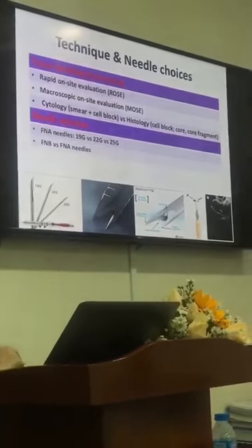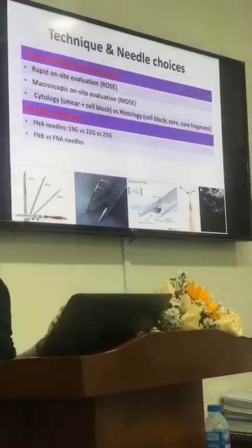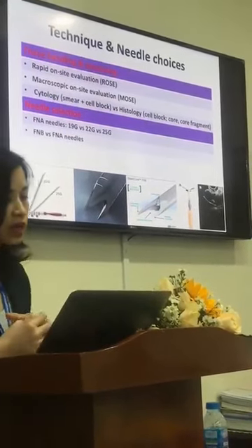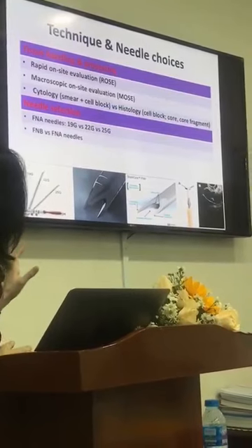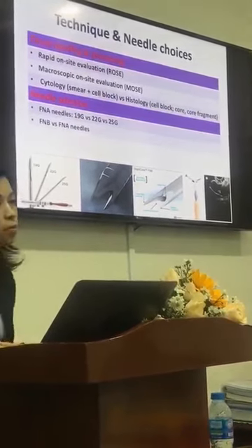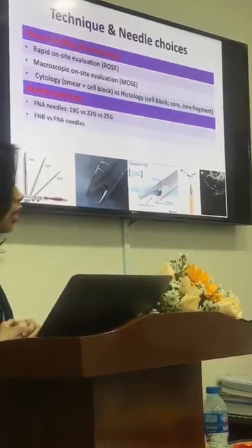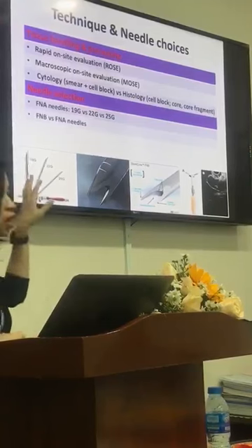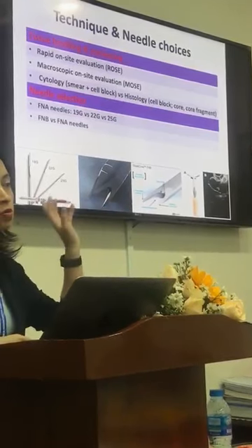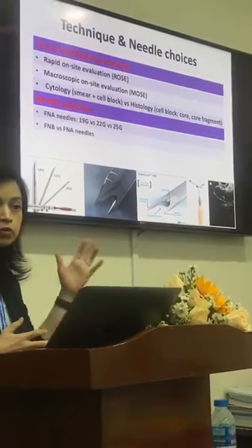Needle selection. Needle selection is very important. FNA has been used and proposed for a long time. We have different sizes of needle, but just recently, a newly designed needle, which is called a biopsy needle or FNB needle, has been released, and we have data comparing FNA and FNB. A lot of people are moving towards FNB, but is that really necessary? We'll talk about it.